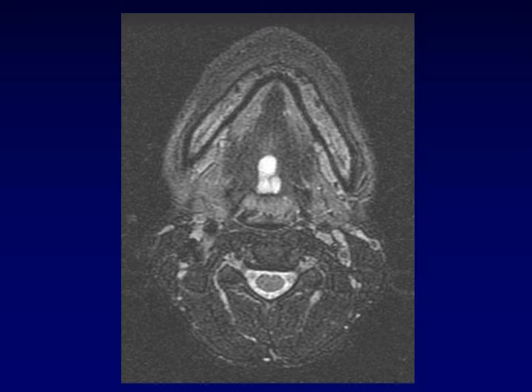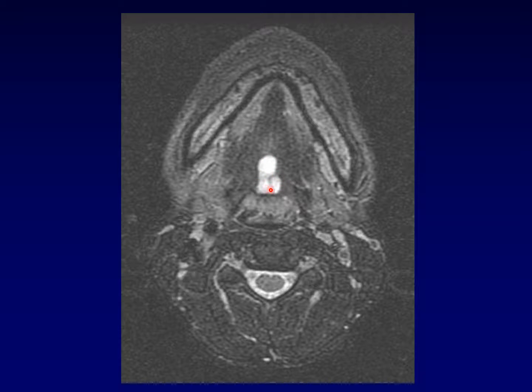This T2-weighted image shows a less classic but still very familiar version of a thyroglossal duct cyst. This isn't down in the strap muscles — we are way up at the base of the tongue. This is the location of the foramen cecum, and so a cystic mass in the posterior tongue is most likely going to be a thyroglossal duct cyst.